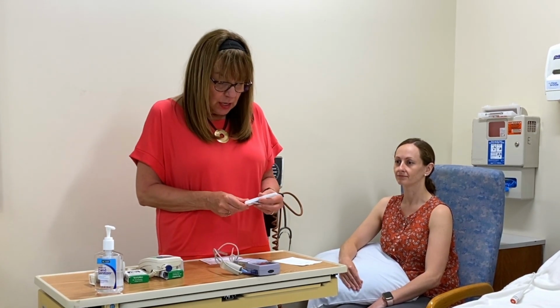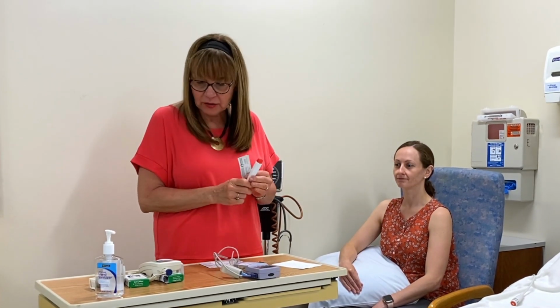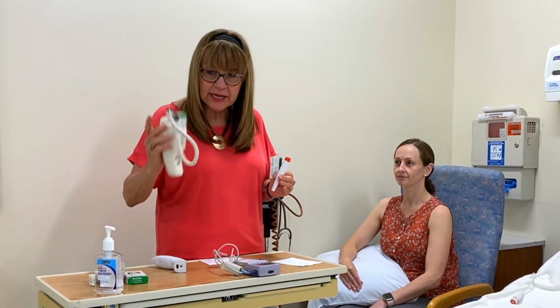And again, when you're taking a rectal temperature, what you want to do is make the patient lay in bed on their left side. That gives you easier access of the thermometer to go into the lower rectal area. You only use a disposable rectal thermometer on the patient if they need a rectal. You don't use any other modality at all. You don't want to contaminate this.